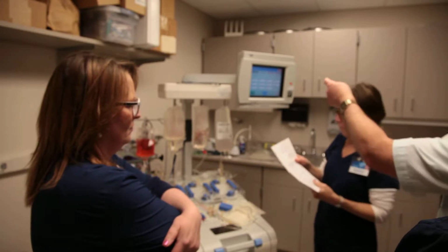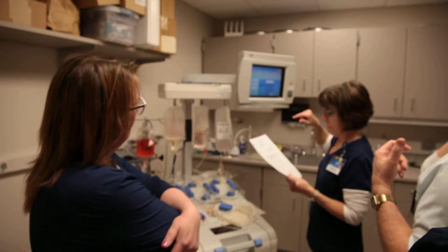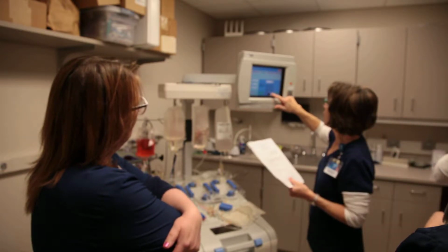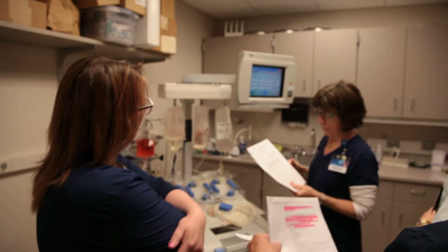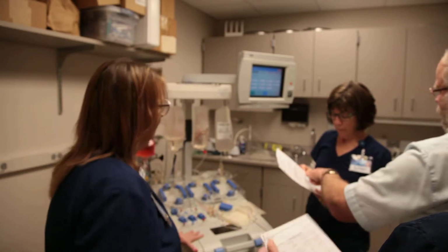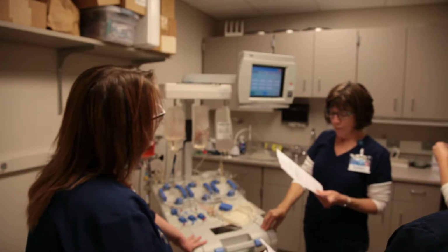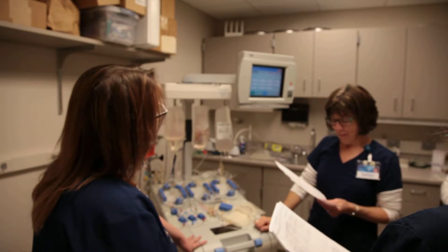So Jane has put in the information, but it thinks it's an adult. So now we did this manually, and we're going to change it here, and the machine will let us do that. Now it'll assume that is the new one. And this becomes an issue if you're doing plasma exchange, because then you're going to have new plasma going too.